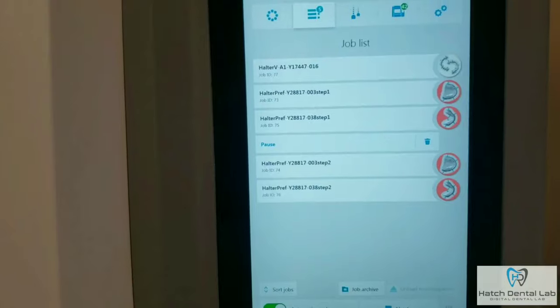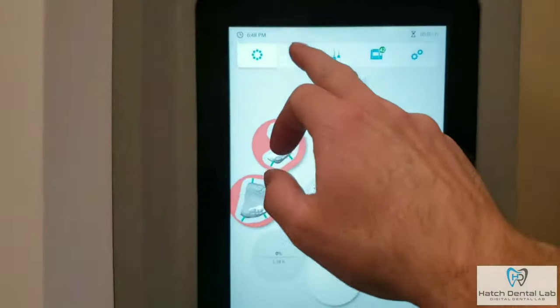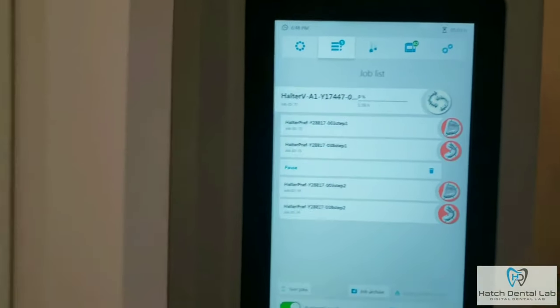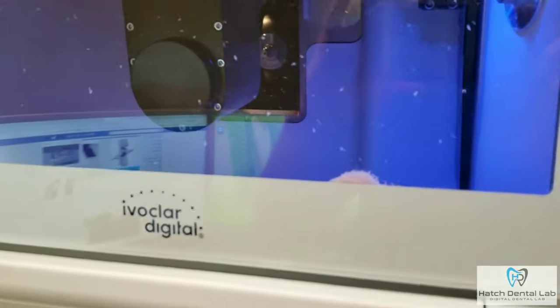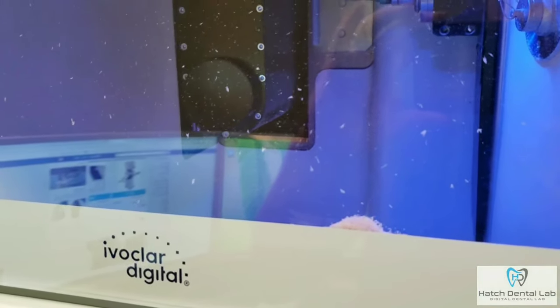Now, the teeth are milled using IvoClar's SR VivaDent CAD teeth material. We do not use cheap knock-off teeth bought from who knows where. Our teeth are made by IvoClar, designed and tested for permanent dentures. They are double cross-linked, durable, and natural looking teeth.